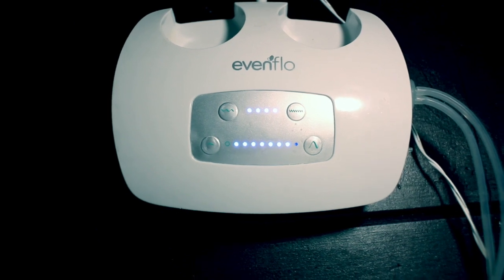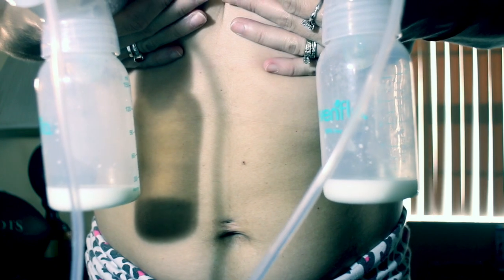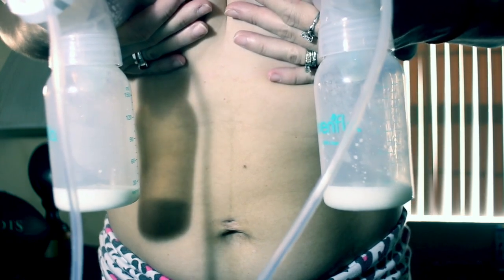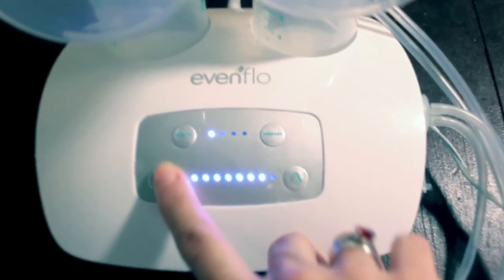I increase it all the way once my nipples are fully comfortable — just one more click. Once I see the last drop of milk, I put the speed all the way down so I have a very slow but steady suck, which gets the rest of the milk out. I leave that on for about 10 more minutes.